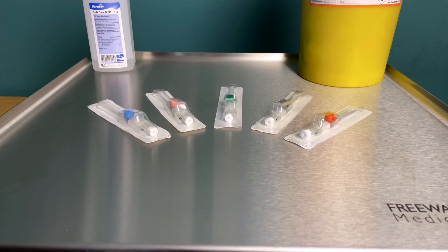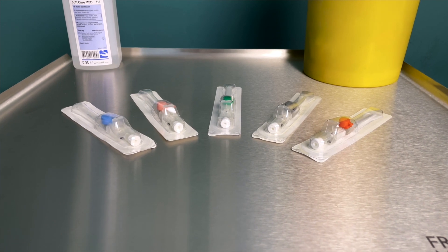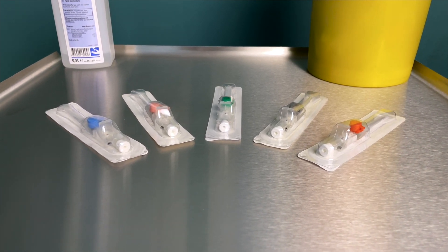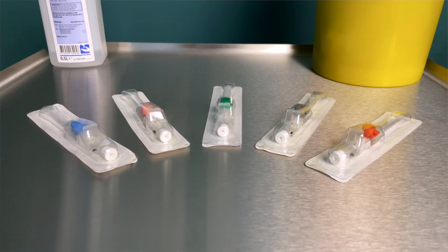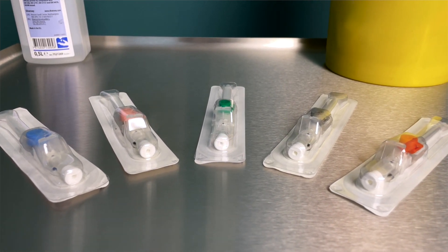The colour of the cannula relates to the diameter of the cannula. Blue cannulas are the smallest and it goes all the way up to orange cannulas which are the largest. Blue cannulas have a flow rate of about 43 mils per minute and are best used in children or elderly patients with difficult IV access.